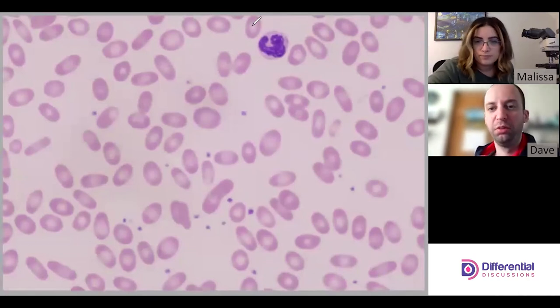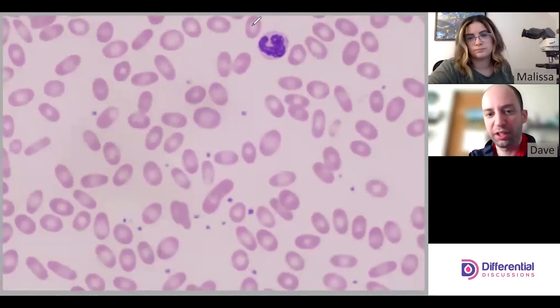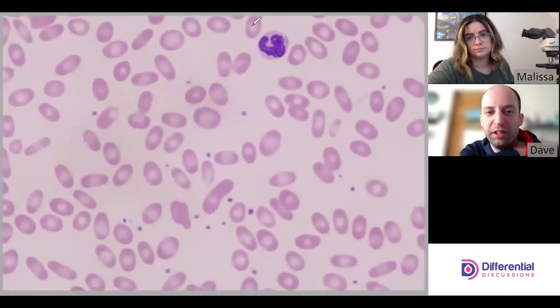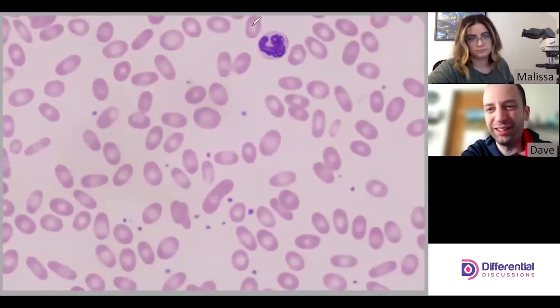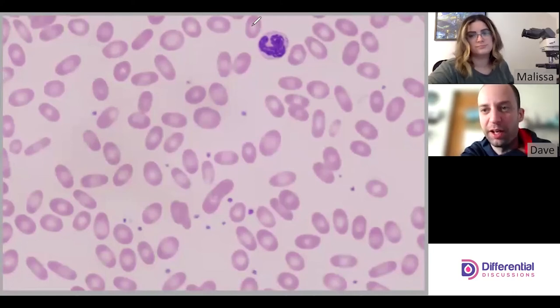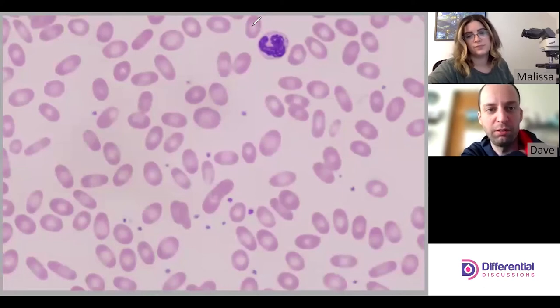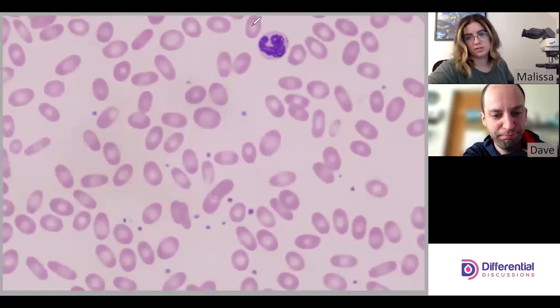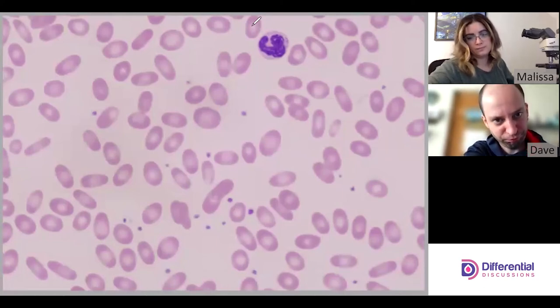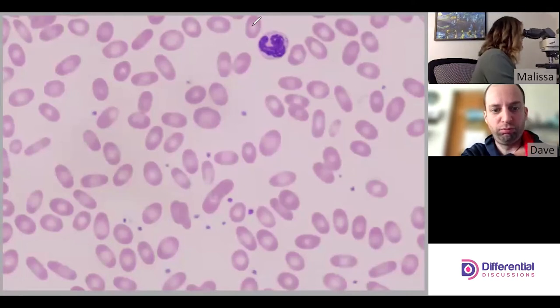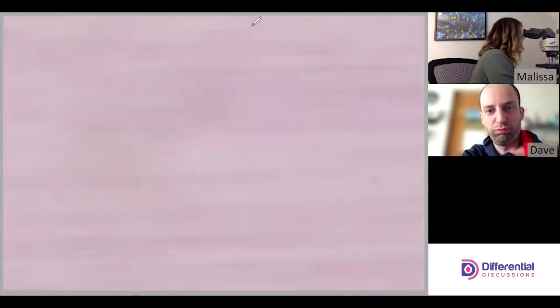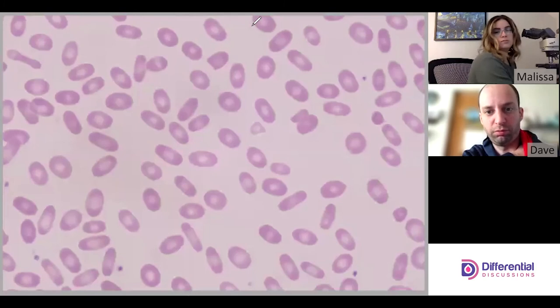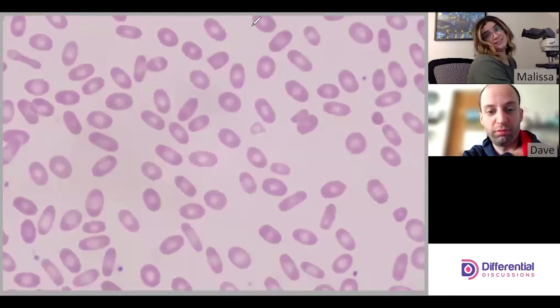While looking at the morphology specifically, we should always be mindful of other things going on in the slide too — like platelets and things like that. That should always be kind of running in the background.